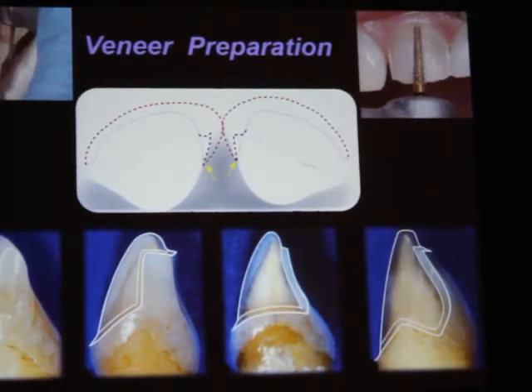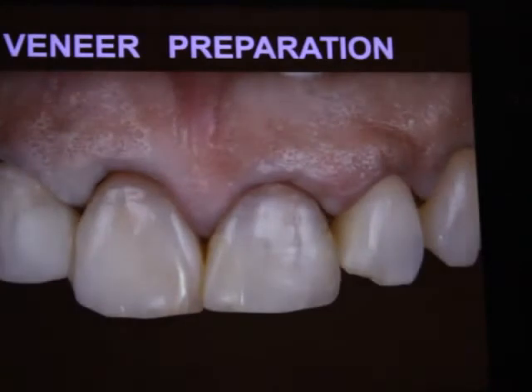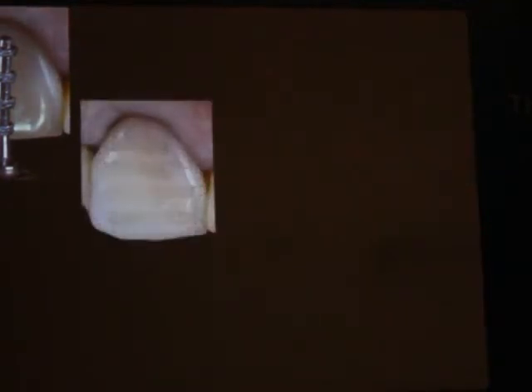Thì đối với việc chuẩn bị veneer chúng ta sẽ có thêm một việc phải kiểm soát, là có những mũi khoan dẫn để kiểm soát việc chúng ta lấy đi bao nhiêu phần men. I mean you can use some burr, special burr for veneer. You have different size, and like that you can control how many millimeter of enamel you eliminate.